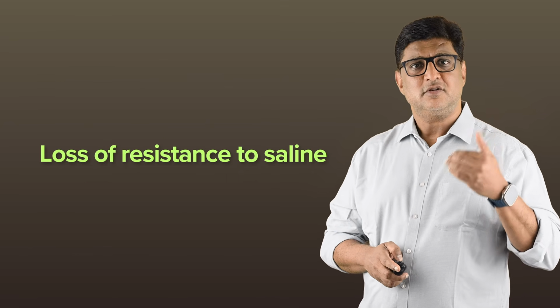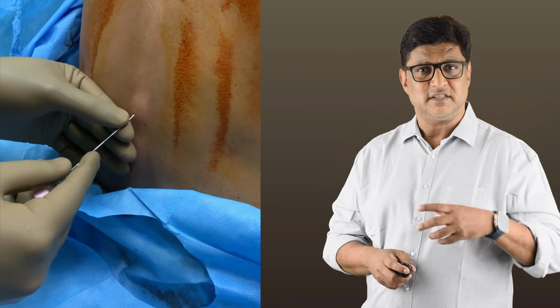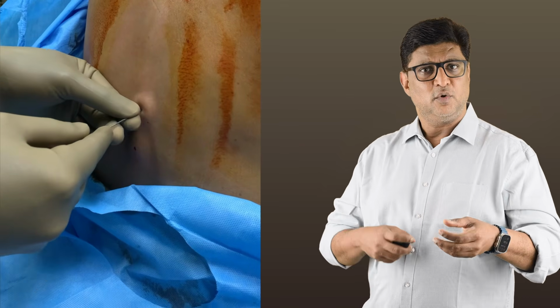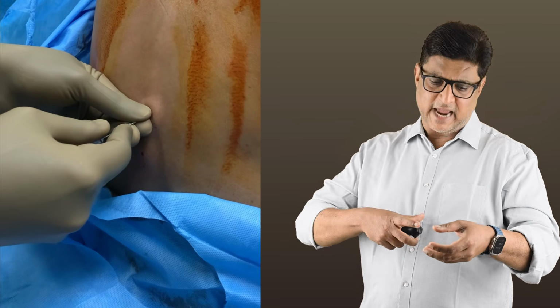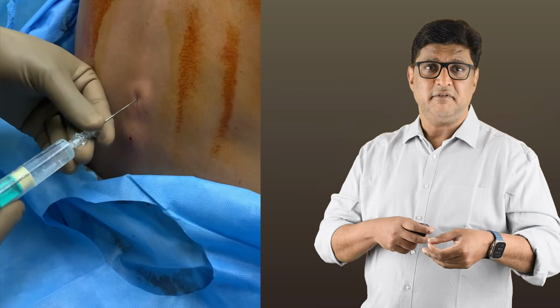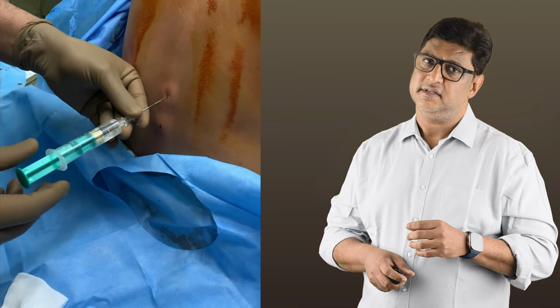So, coming to the loss of resistance to saline technique. This technique involves gentle continuous pressure using saline in the syringe while advancing with the epidural needle, which acts as a single unit, until we feel the sudden giveaway indicating entry into the epidural space.